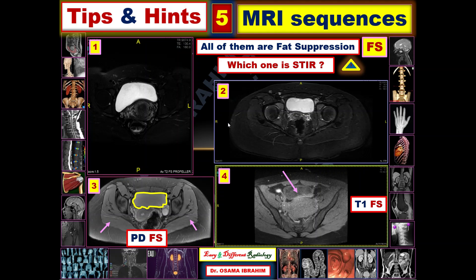The remaining two images, number one and number two — which one is the STIR? Both have high signal in the urinary bladder or water, both have fat suppression and suppression of signals in the bones. You need another helper to differentiate: the MRI parameters written in the corner of the image. There are TR (time of repetition), TE (time of echo), and FA (flip angle). STIR imaging depends on the inversion recovery sequence and requires a time of inversion TI.